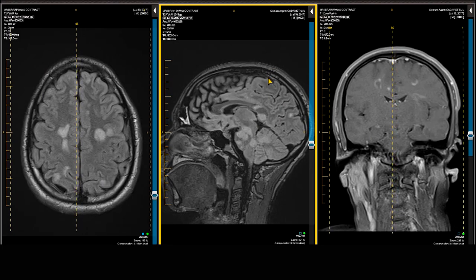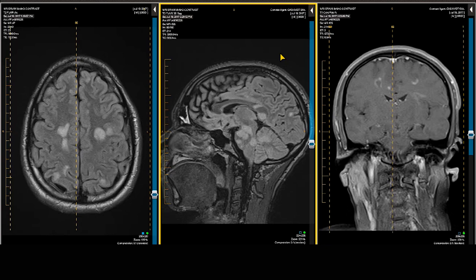One area to look at closely is the callosal-septal interface — the interface between the corpus callosum and the septum pellucidum. We look at this area for focal areas of demyelination because that is relatively specific for multiple sclerosis. It is not identified in this particular case, but it is relatively specific for multiple sclerosis and helpful in the differential diagnosis of demyelinating disorders.